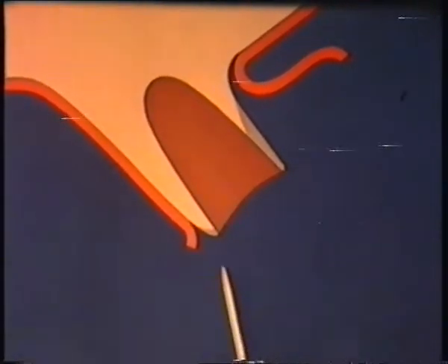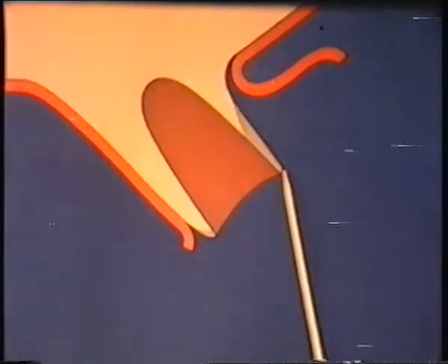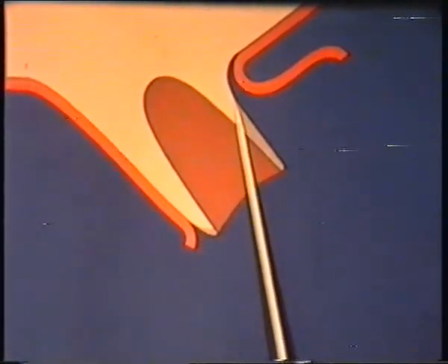The next procedure is to remove as much of the alveolar bone as will be necessary to allow the upper denture, with its labial flange, to be fitted successfully. The shaded areas on the diagram indicate approximately the amount of bone which is to be removed.